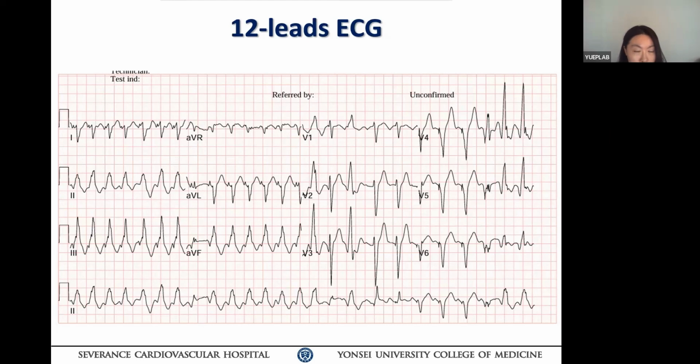So the location of the VT. Can you predict the location? Yes. If V1 and V2 are positive, V3 is positive, then V4 becomes negative, V5 and V6 are S waves, so it's likely subvalvular from the left side. But I think that is paced rhythm. You mentioned pacing spikes in V5 and V6, but the last two beats might be the tachycardia, right? So it's mainly positive concordance, coming from the left side, left basal, mitral annular, and even negative, mitral anterolateral. Okay. Theo, do you agree?